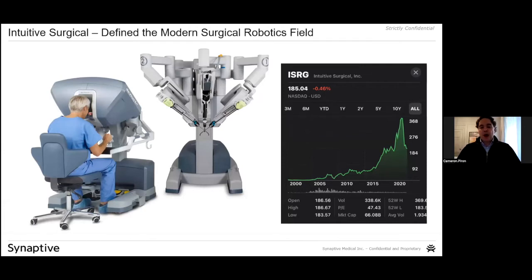The theme today is really robotics, and I did want to talk about a company that really defined surgical robotics, a company called Intuitive Surgical. It was formed out of licensing technology from Stanford and robotics, much like I licensed technology that I developed at Sunnybrook and spun that out. The idea is that a surgeon could be decoupled from being right there with the patient and have these dexterous robots, really complicated pulley systems, to improve the dexterity. They use an endoscope so you can optically visualize what's happening.